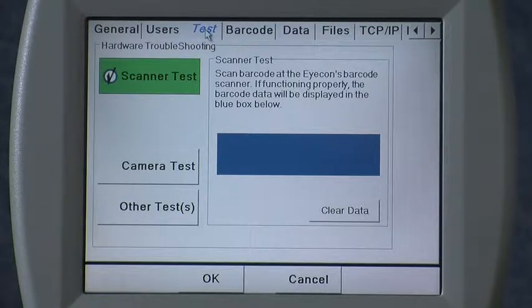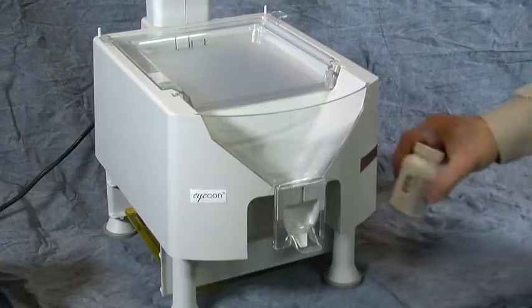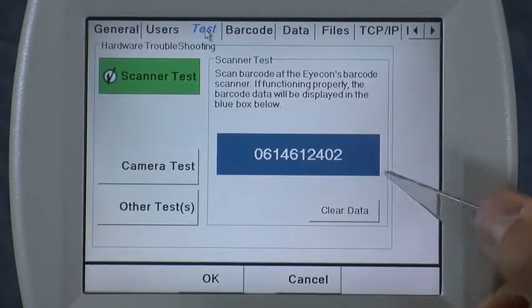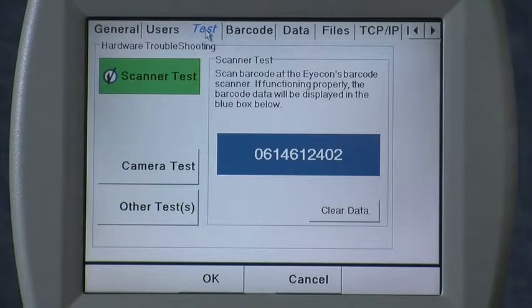If you're having trouble or you're just setting up your Eyecon for the first time, when you call the factory for assistance setting that up, we will probably have to go to this tab and scan the barcode. Simply scan your barcode and all of the digits contained within the barcode are displayed. If you're reading them off to us, if there are any spaces or anything like that, make sure you also read those to us because it's important to know where any spaces are contained in your barcode.